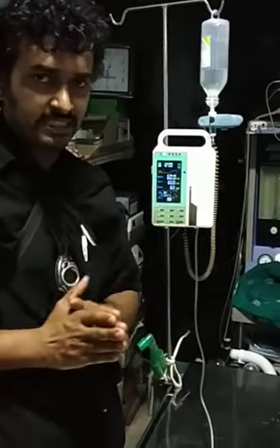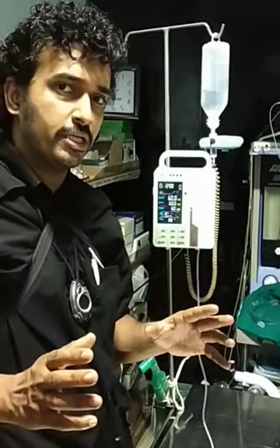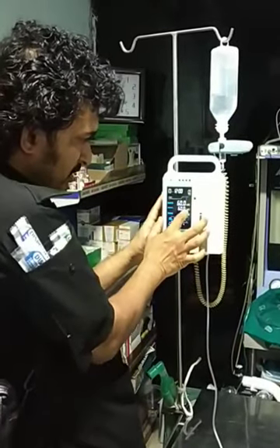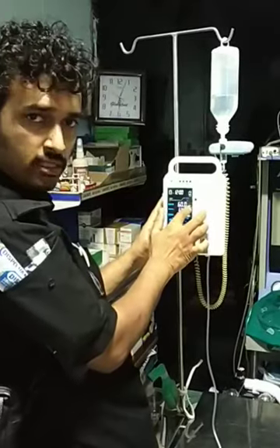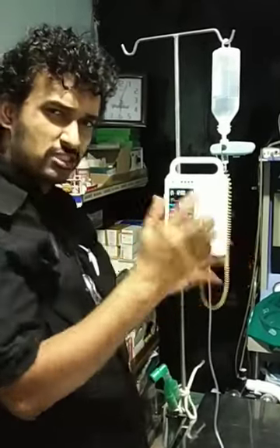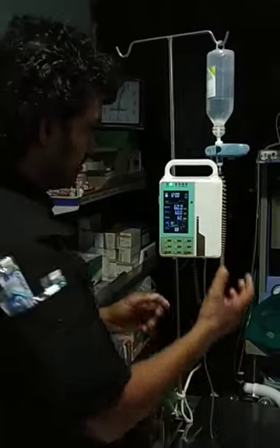For example, if my dog is 6 kg and it needs 10 ml per kg per hour, what would be my target volume in an hour? It would be 60 ml. So if you see, the target volume is 60 ml and the time is 60 minutes, so the rate comes automatically — for easy understanding, it is 60 ml per hour. We kept 60 because one minute has 60 seconds and one hour has 60 minutes.